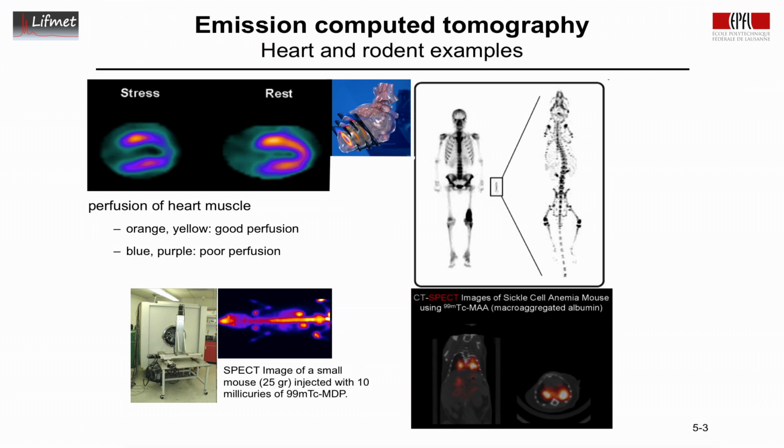We see the bone is bright, we see here the rib cage, we see here other bone structures. Here's a cut through the torso, again the rib cage, and the spine back here. This serves to give a background anatomical image which serves to identify exactly the areas of high uptake, here in this case of metastable technetium.